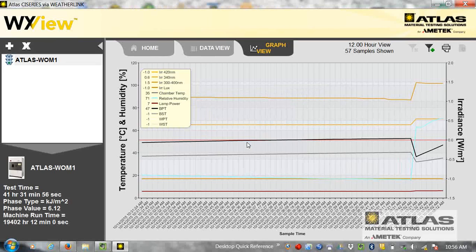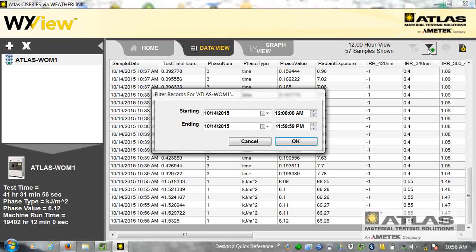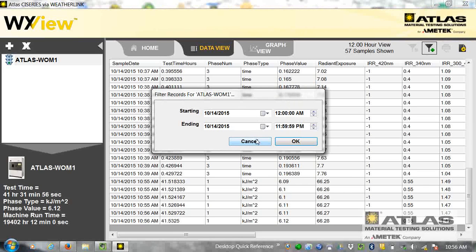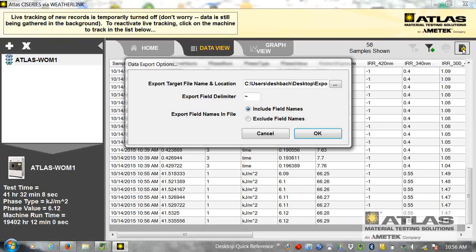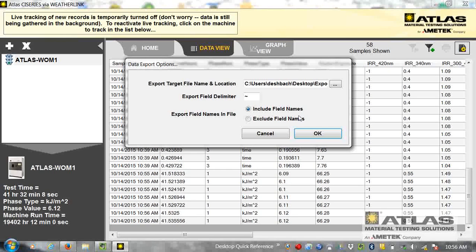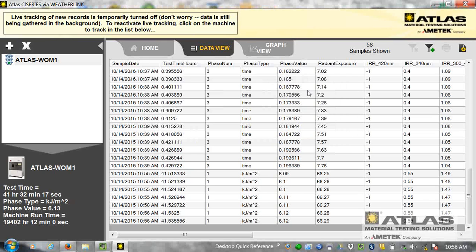If I go over to data view, it has the same thing. I can also export the raw data, and I can tell it where to save it and what to use as a delimiter and open in Excel and a lot of possibilities once it's in Excel.